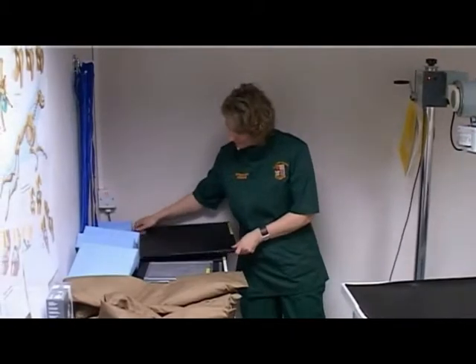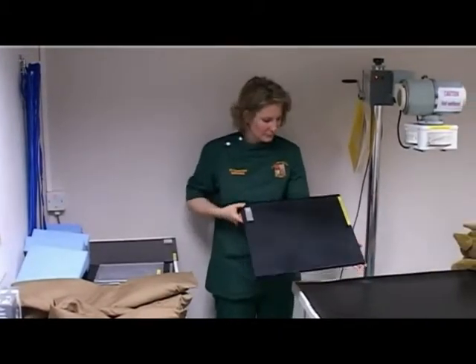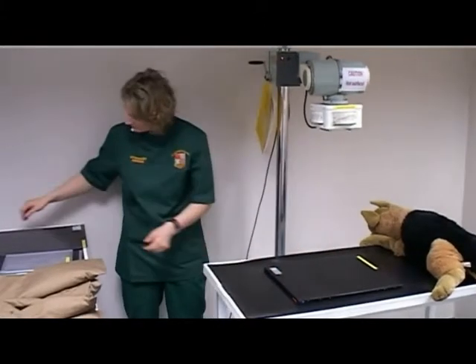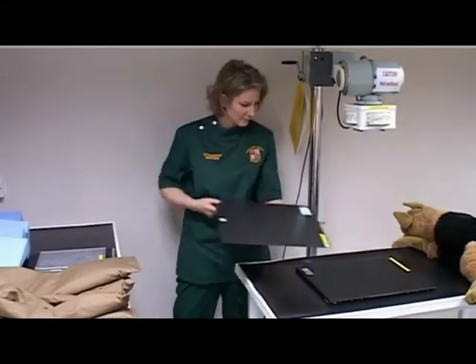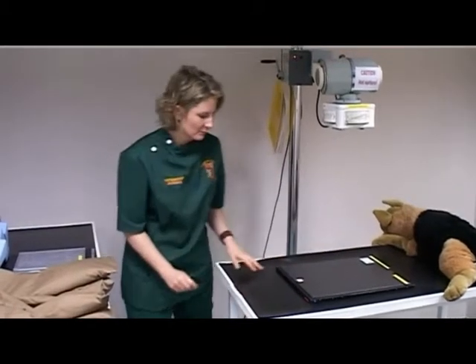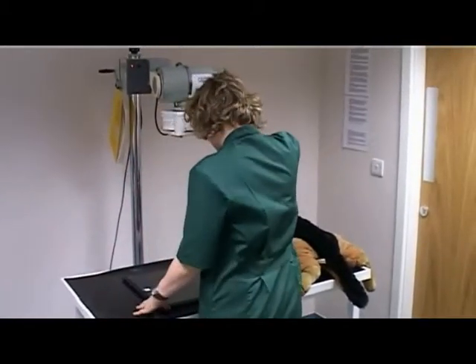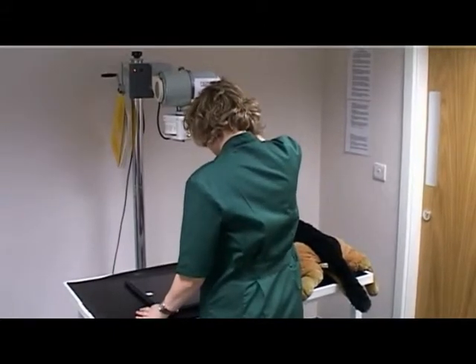Select a large sized cassette and place it the correct way up on the table. Select an appropriately sized stationary grid and place it exactly on top of the cassette, ensuring it is the correct way up. Collimate to within the edges of the grid.